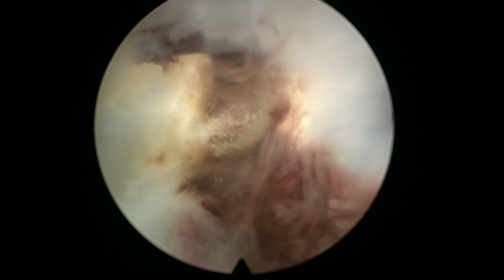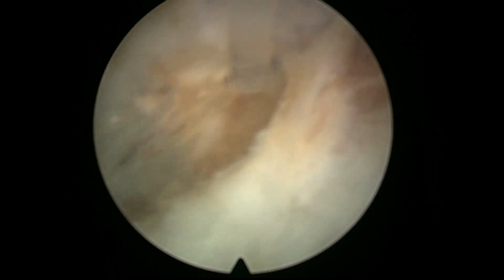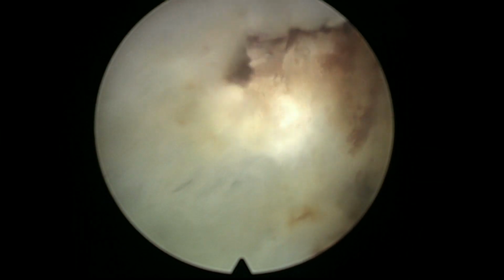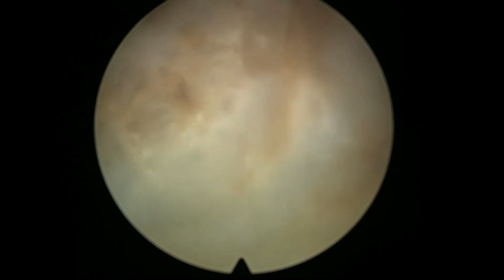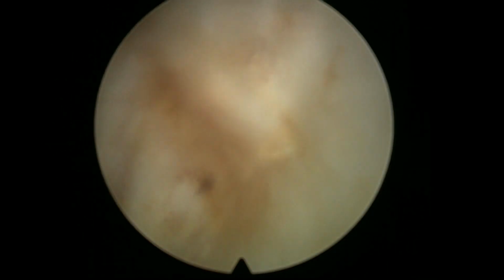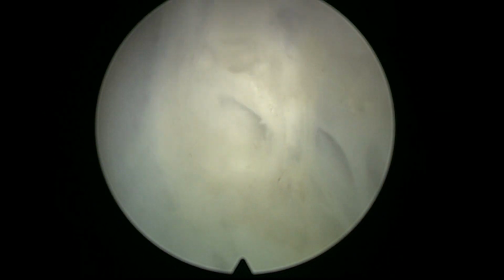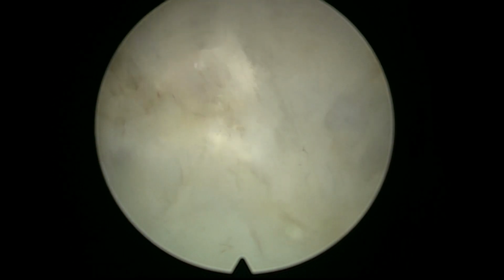Trying to progress slowly. You can see how rigid the tissue is, and it felt very rigid, but slowly, without doing a lot of force, we can progress with our dissection. There you are. That is the beautiful effect of this virtual basket energy, double pulse, double bubble, as they call it. It really has an enhanced cutting ability. So in cases like this, it could be a big advantage because it really disrupts the tissue and helps doing this dissection.